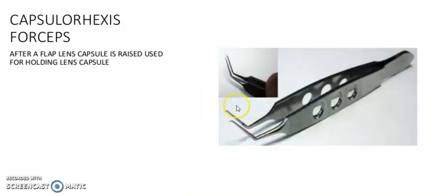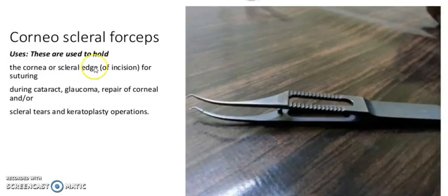It is capsulorhexis forceps. After a flap of the lens capsule is raised, it is used for holding the lens capsule. It is corneoscleral forceps. These are used to hold the corneal or scleral edge for suturing during cataract, glaucoma, repair of corneal and scleral tears, and keratoplasty operations.